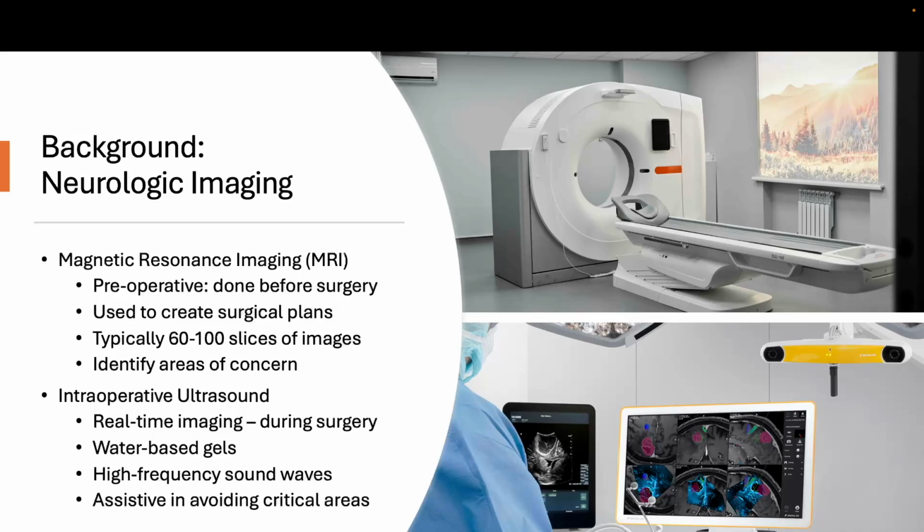There's also intraoperative ultrasound, which is real-time imaging during surgery, and this typically uses water-based gels and high-frequency sound waves. The probe records the sound waves transmitted outwards and then receives them, and this is useful for avoiding critical areas in the brain.